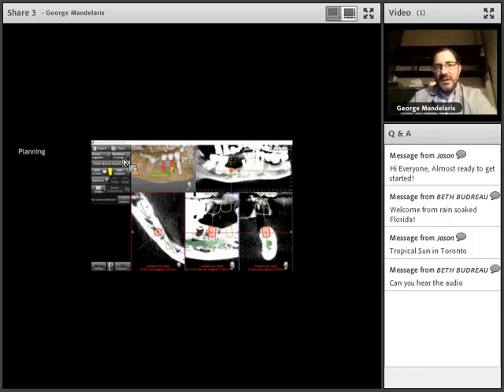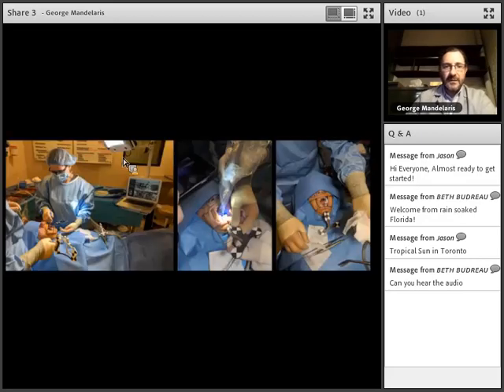So here's a case where we elected not to do any vertical ridge augmentation. There's some proximity to the inferior alveolar nerve. Basically, we had an implant placed at the number 28 position, and so we're going to 27 position rather. So we're going to go ahead and place 2 short implants and tie these 3 fixtures together for a fixed prosthesis. So there's my planning. This is a 4 by 6 millimeter Astra implant here.